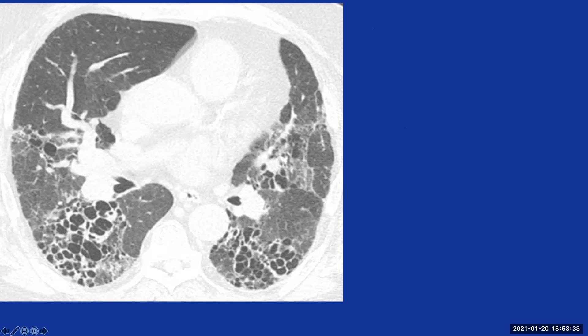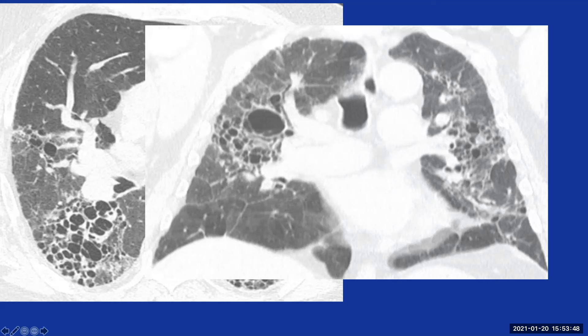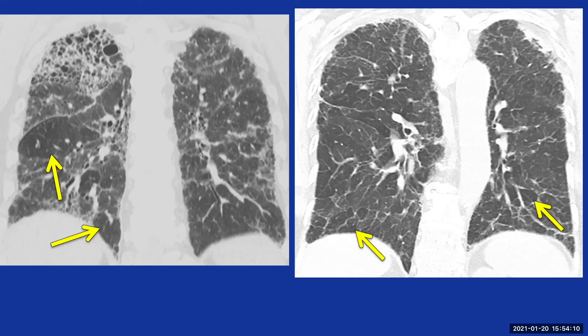Here's an example with cystic abnormalities in the lower lobes and more anteriorly, representing traction bronchiectasis, bronchiolectasis, and probable subpleural honeycombing. On the coronal reformation, we see lobular areas of lower density — mosaic attenuation highly likely to represent air trapping. The distribution of fibrosis is mid or upper lung preponderant, mostly mid-lung, with a background of hazy ground glass abnormality. This is a typical fibrotic HP pattern.